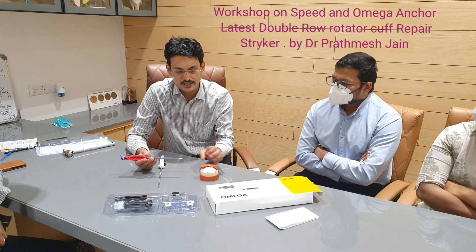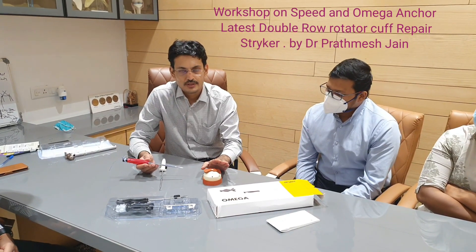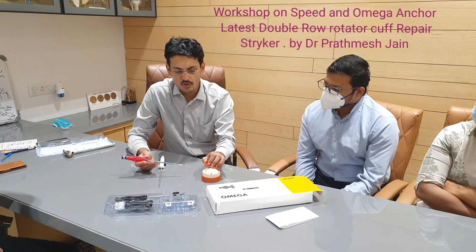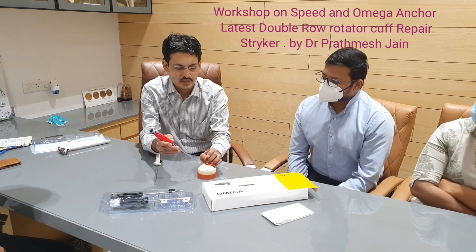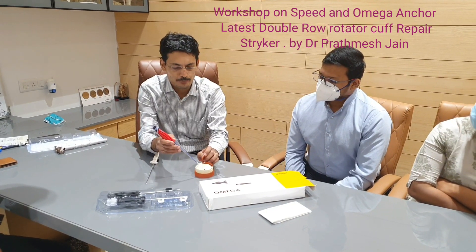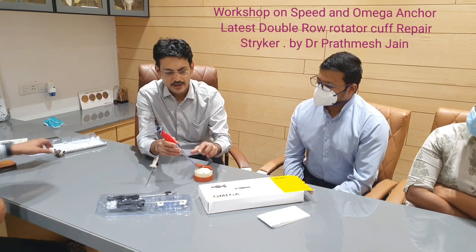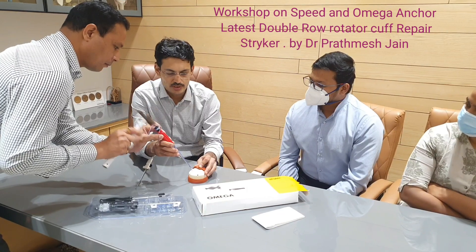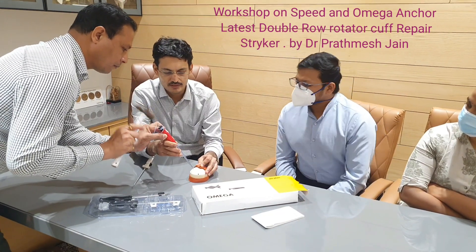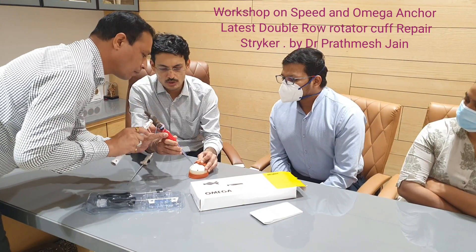I will be demonstrating how to repair the rotator cuff in a double-row fashion. If you want to repair the rotator cuff with this Speed anchor, you can place the anchor on the medial aspect and just tap the anchor in like this. This is a self-tapping anchor, as compared to any other all-suture anchor.